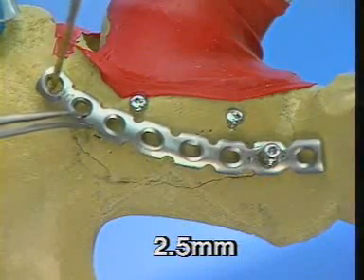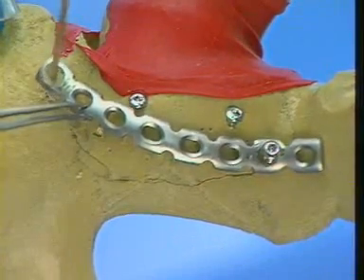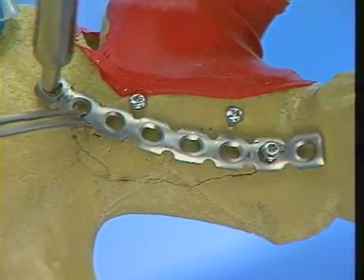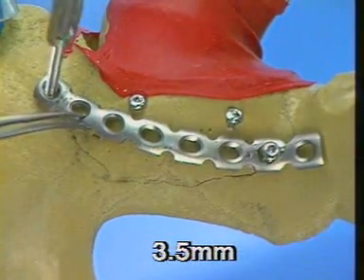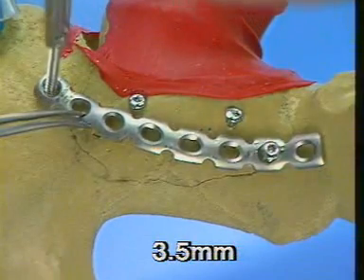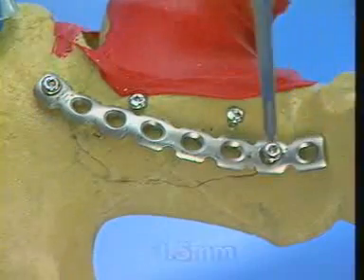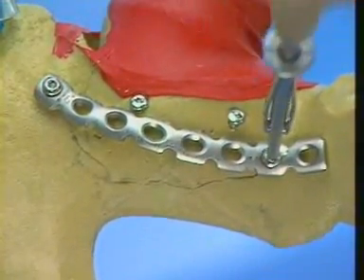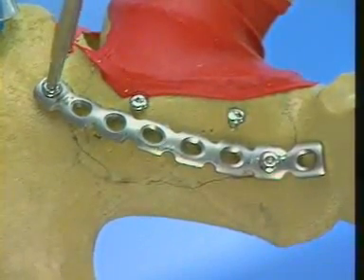A 2.5 millimeter drill hole is drilled through the upper screw hole at the upper extremity of the hole in order to create a compression effect. Measure the depth and insert the screw. Tighten the screws at the two ends of the plate alternately to complete the bending of the plate and tension it over the posterior wall fragments.